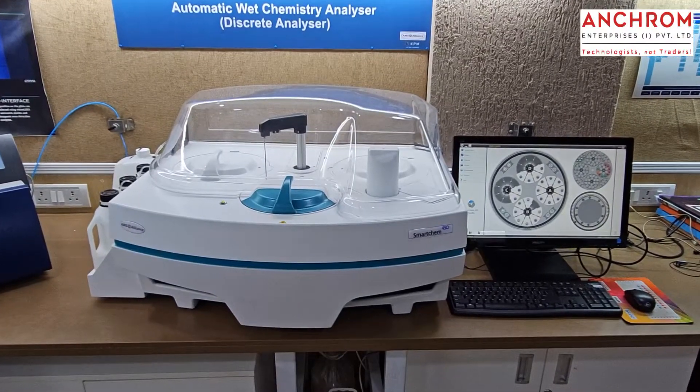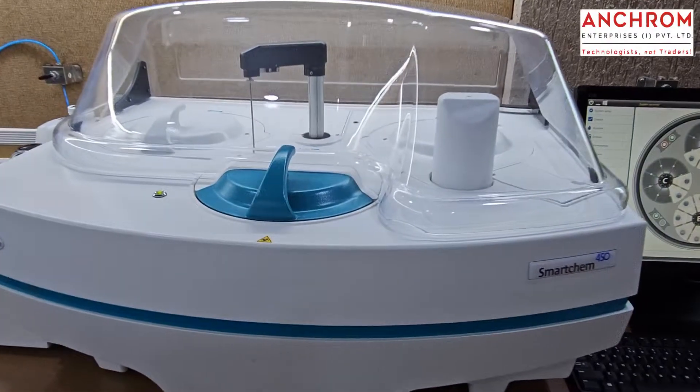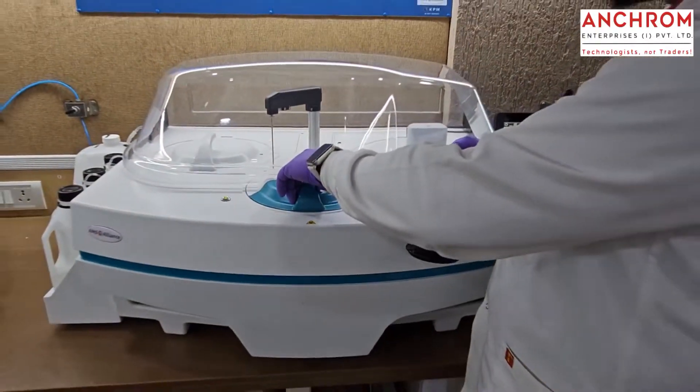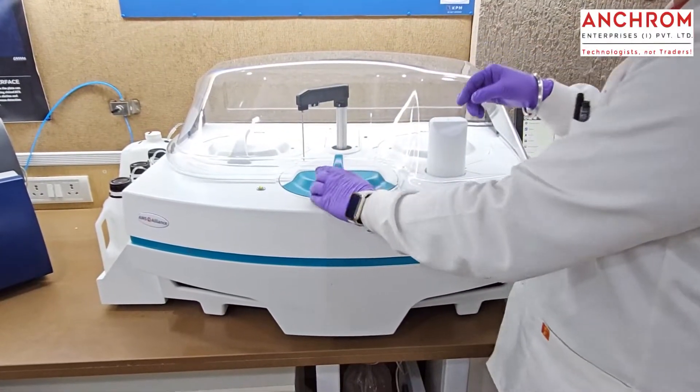Let's see how easy it is to analyze a large number of water quality parameters using the SmartCom 450 Discrete Analyzer from AMS Alliance. Just put your water samples into the sample bay, which has 100 sample positions. These are just water samples without any sample prep.